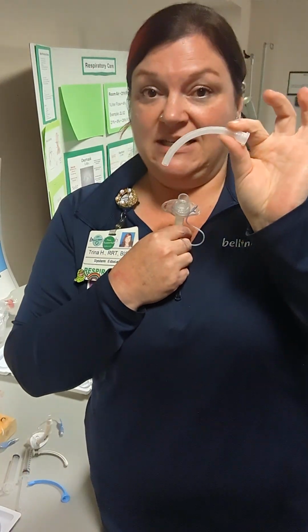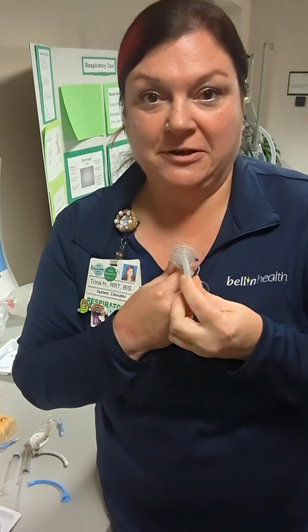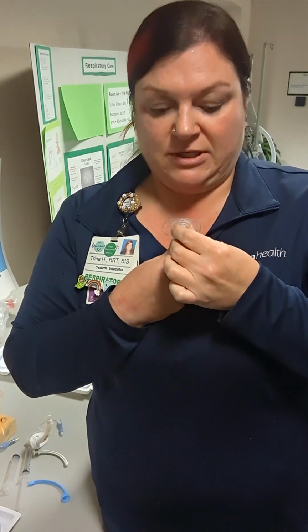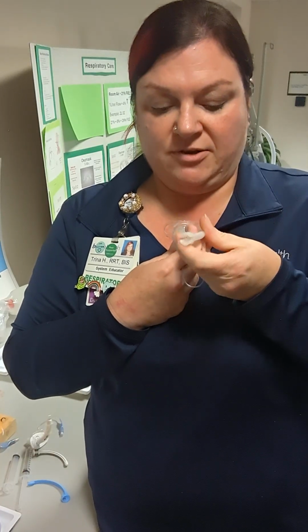The other piece is called an inner cannula. So an inner cannula goes inside the airway, and it just kind of snaps in there. And it allows for us to keep not only a patent airway, meaning it's open, but it also allows us to keep it clean. So those secretions, anything that's going to collect in that airway, the inner cannula is a nice barrier to the device itself.